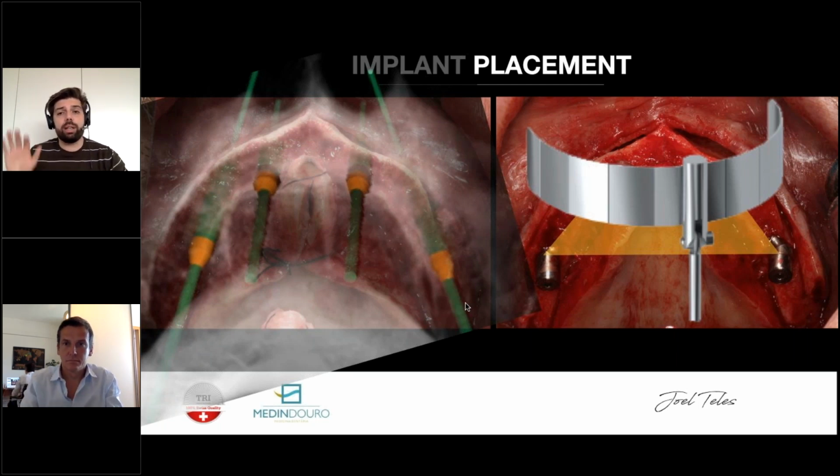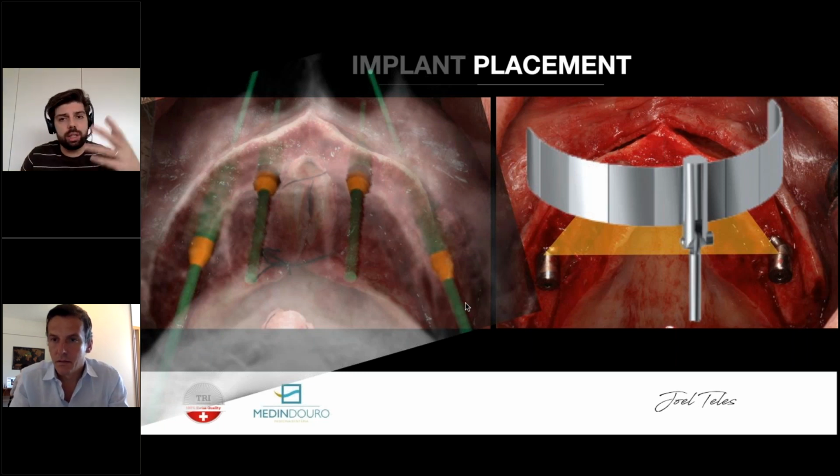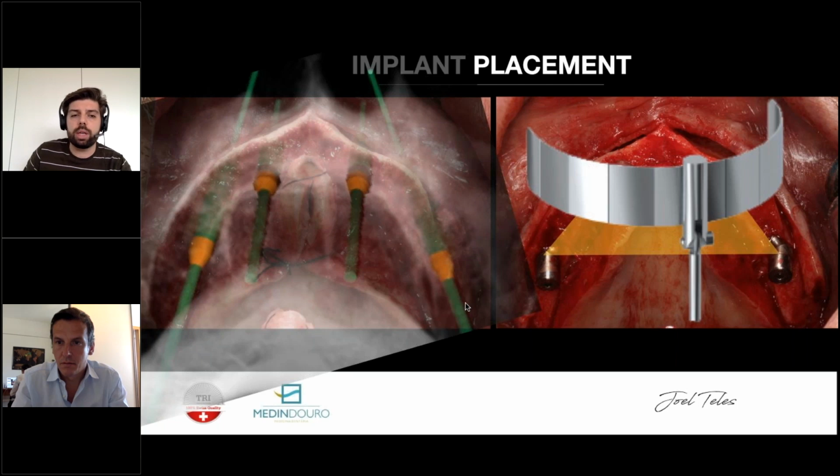Like I told you in the webinar, it moves a little bit around, and there are some with inclination guides from 30 to 45 degrees. Those are easy to buy, and it can be useful for who's starting all-on-4 treatment. So buy one of those with the angulations as well. This one doesn't have it. It's the image that I picked up online to answer your question, but pick up one of those and you'll be more comfortable.